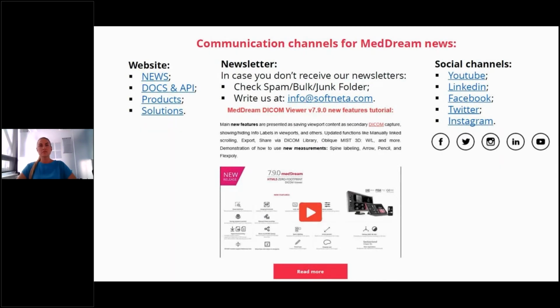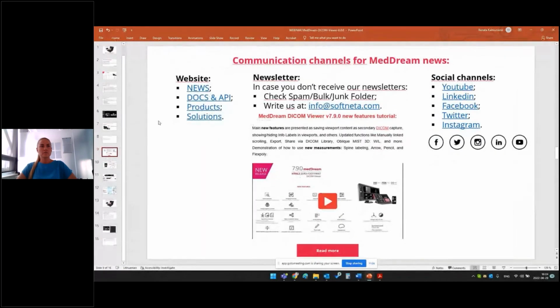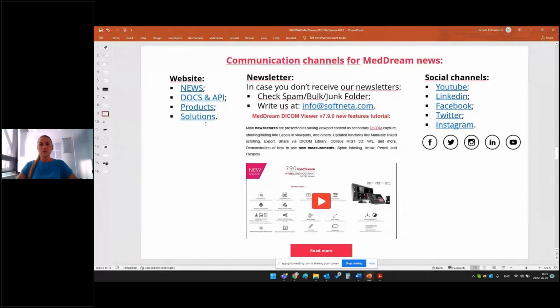Thank you, Vytautas. Hello, everyone. We have some channels to pass MedDream news, like new features, new releases, or videos, or some documents, and so on. So the main tool is the website. I will show you. It's news, documentation, product pages and solutions.